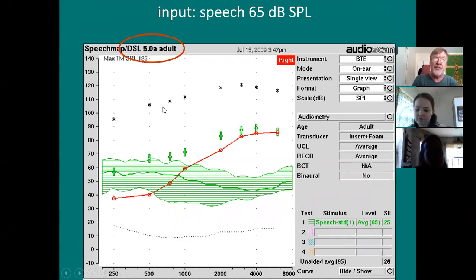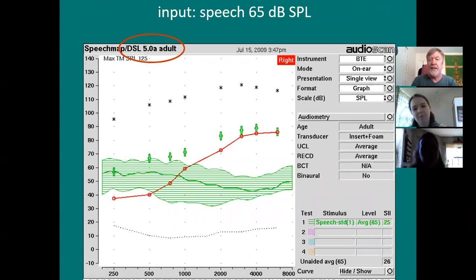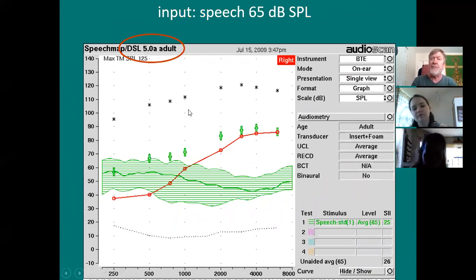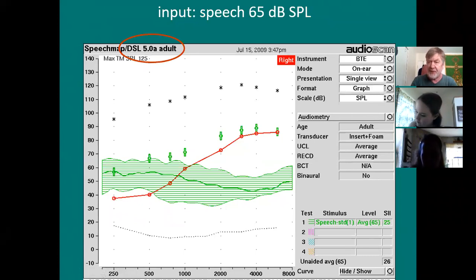You'll see the asterisks at the top — frequency-specific loudness tolerance levels. So now you can really get a great display of the floor versus the ceiling. That's the big advantage of today's real ear: it's better for counseling. It makes more sense.